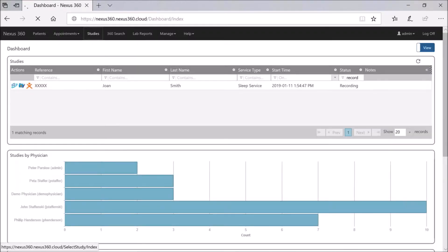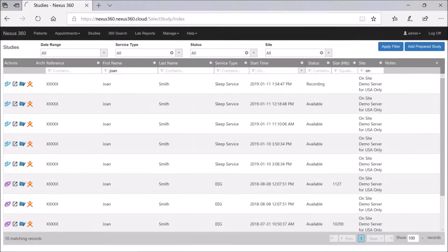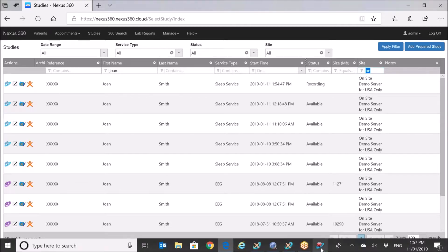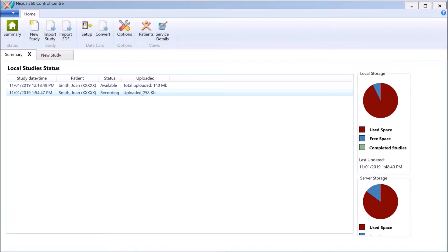Now if I go to my Studies tab, you want to make sure the service type and site are correct in terms of what you set up for the acquisition. I've got filters here — filtering to show just the On-site Demo Server — and here is Jane Smith. You can see this study is now recording. If I was remote, I could log into the Nexus 360 page and see that this data is actively being recorded.